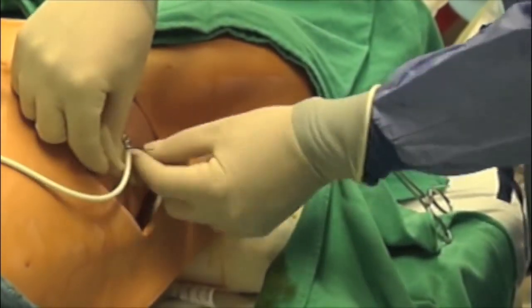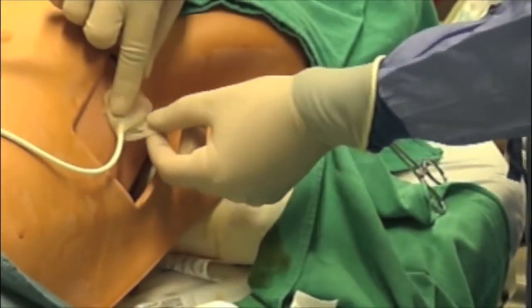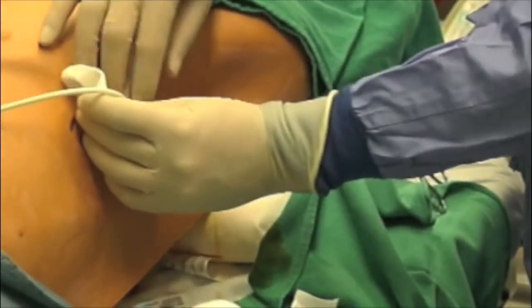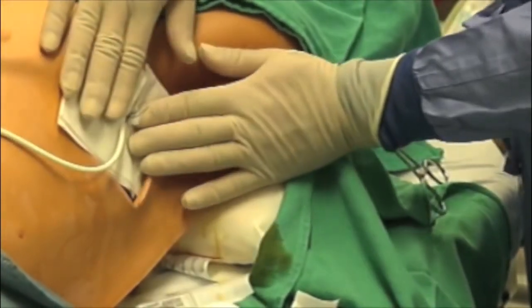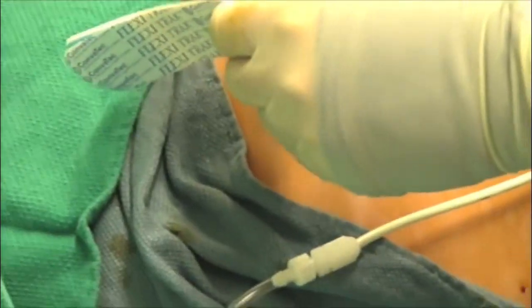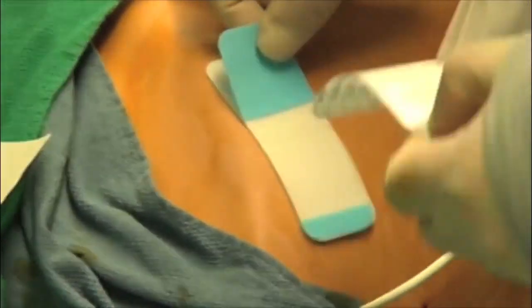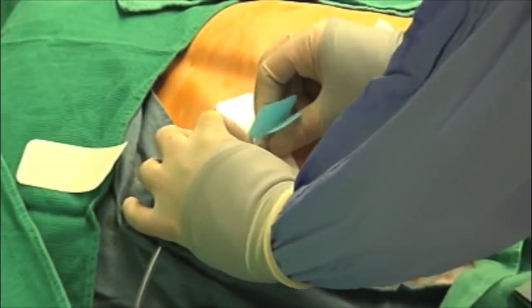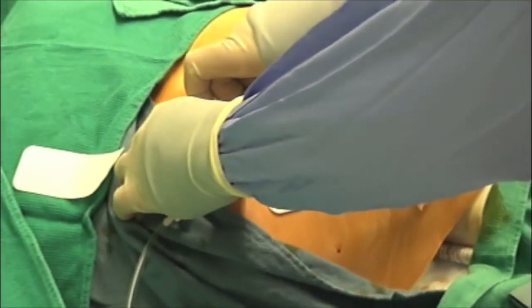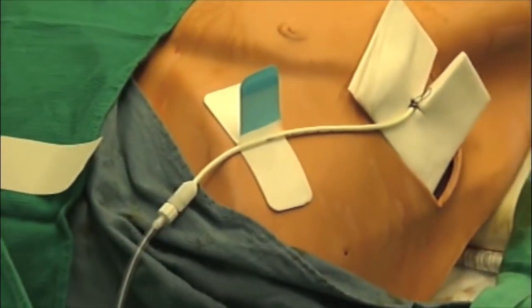Apply an occlusive dressing, such as Adaptic, and drain sponges. Tape the pigtail to the chest. A FlexiTrack may be used. Finish the dressing with Mefix, avoiding the nipple.